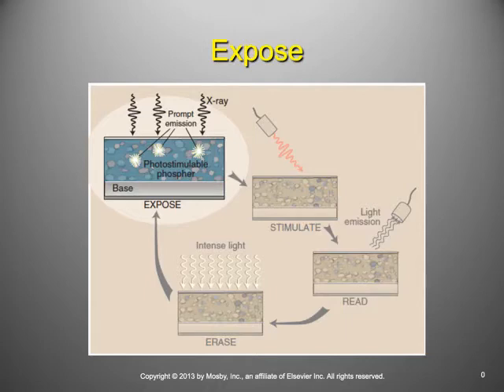It's actually the exact same stuff that's inside of PSP. So the exact same stuff that we are using to capture the remnant beam exiting the patient is the same stuff that's inside of this crystal made by Landauer that we use to detect our occupational exposure. And they go through a very similar process of stimulation with a laser and then readout.